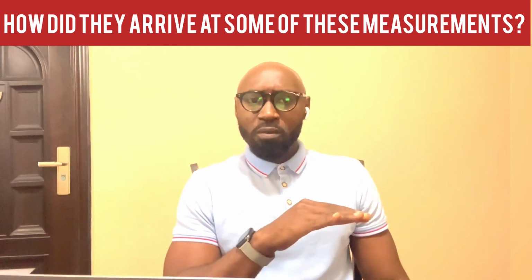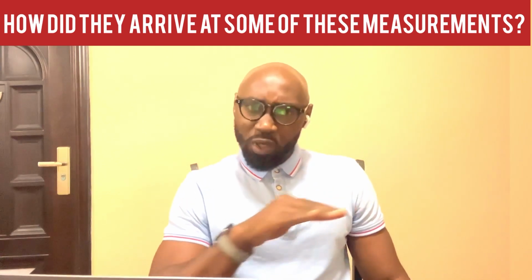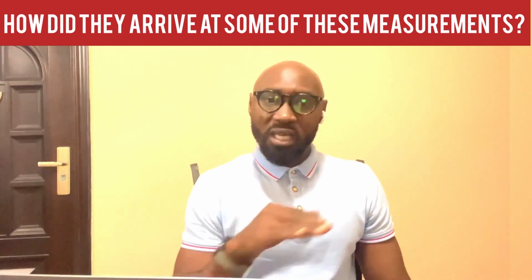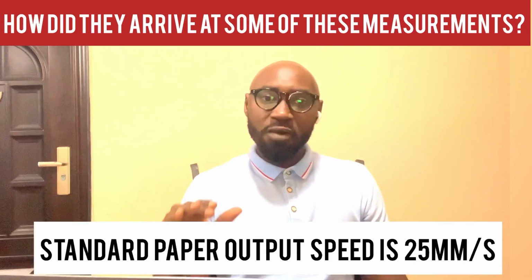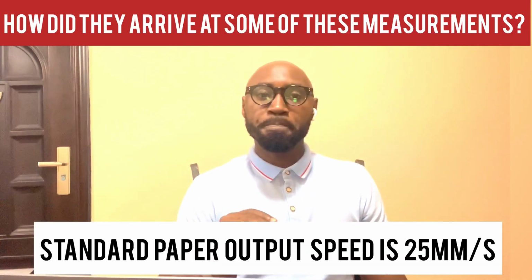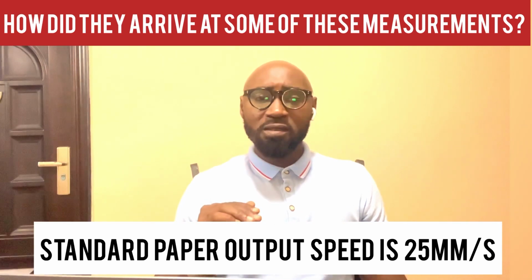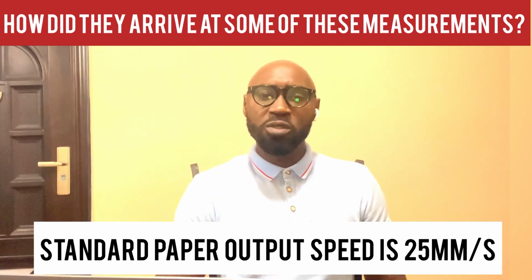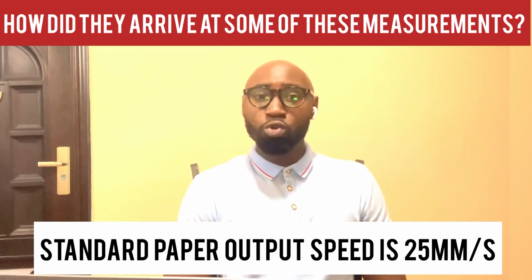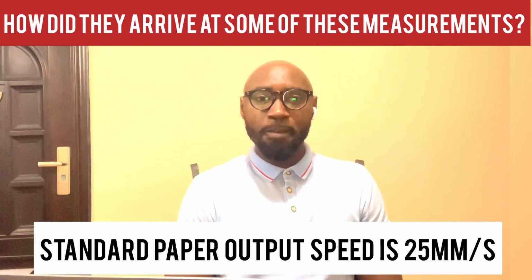In doing this, let's take a look at the horizontal axis that measures time in fractions of a second. On this axis, the standard paper output speed that is usually used is 25 millimeters per second.